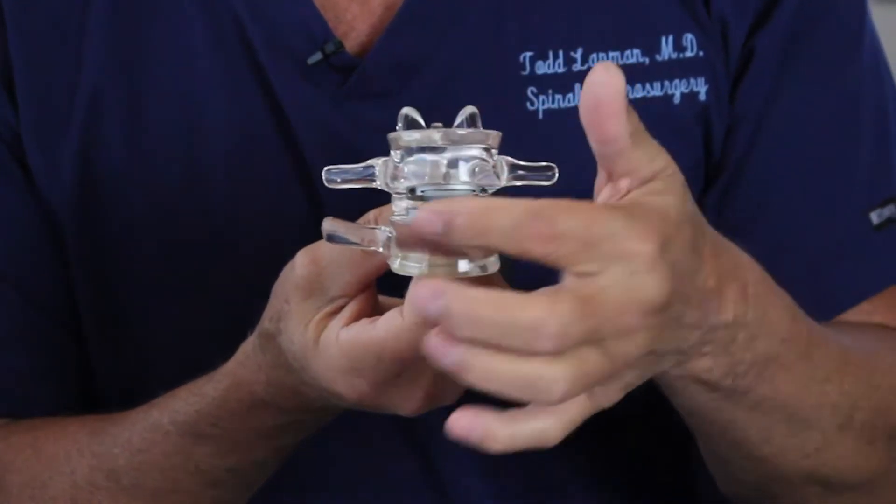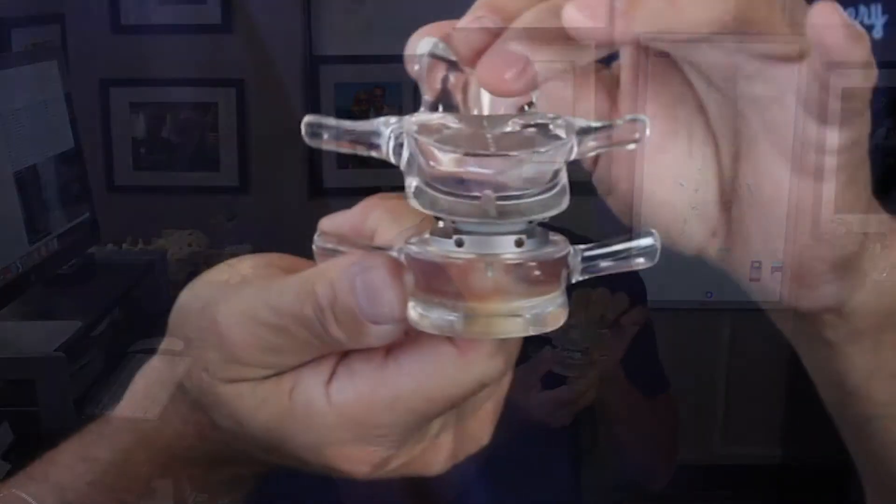This whole thing between the two clear acrylic pieces is the artificial disc, and they work because it's a ball-and-socket to allow motion, so the spine continues to move.